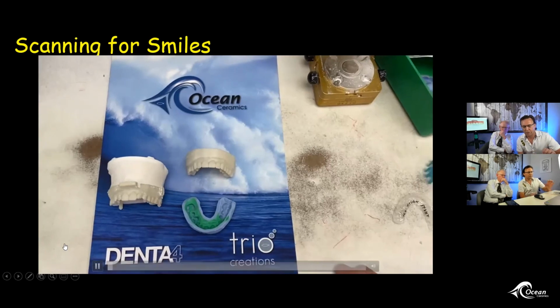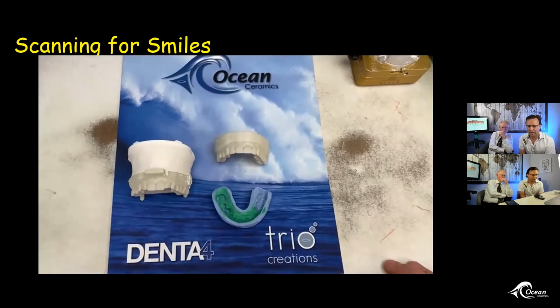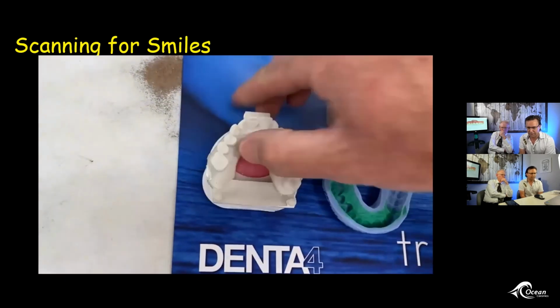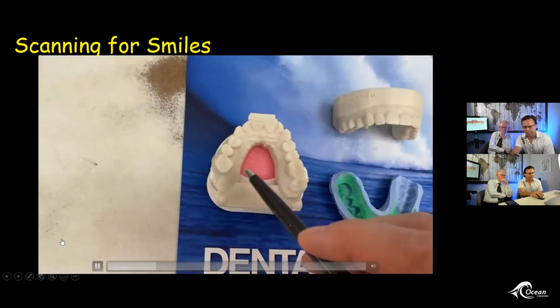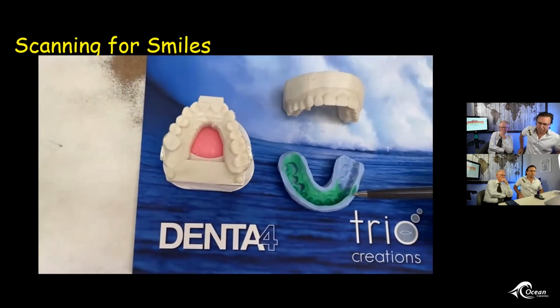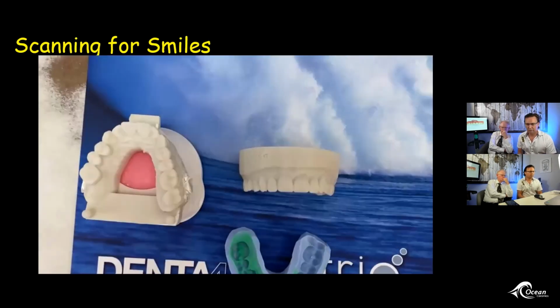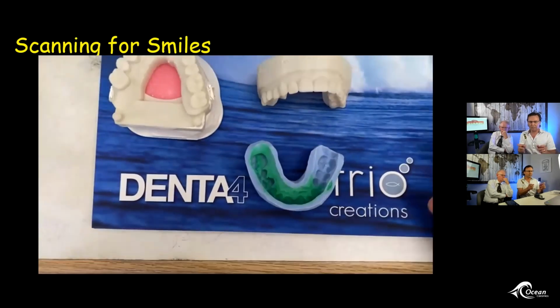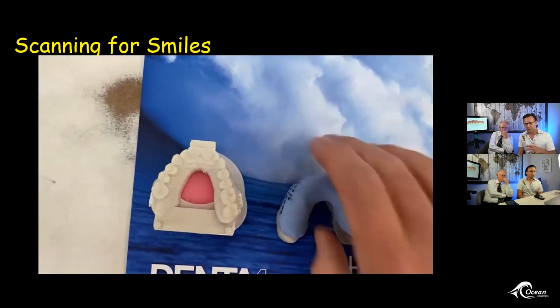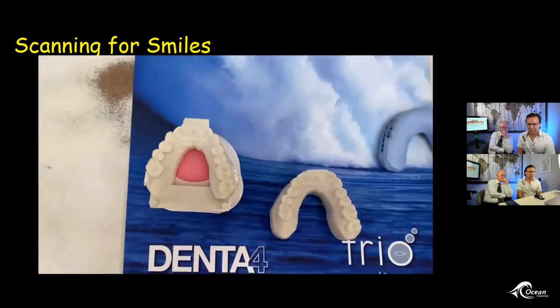When you are doing any smile design, it's absolutely imperative that you scan the palate and also the hamular notches. Very critical data when we're developing smiles, leveling out horizontals, and positioning the maxilla. So we're missing the palate here. That's the most important positive stop for that putty tray to seat so that the waxed up teeth will seat properly, so that we can evaluate the wax up in the mouth. And actually, when we did Mark's smile here, we did just that. All we had originally was the teeth and no tissue, no vestibular areas, palate, or anything. I said, dude, we have to rescan. So he got rescanned, and then we knocked out his wax up with accuracy. Because when that putty tray seats, we want that palate to be the primary positive stop.